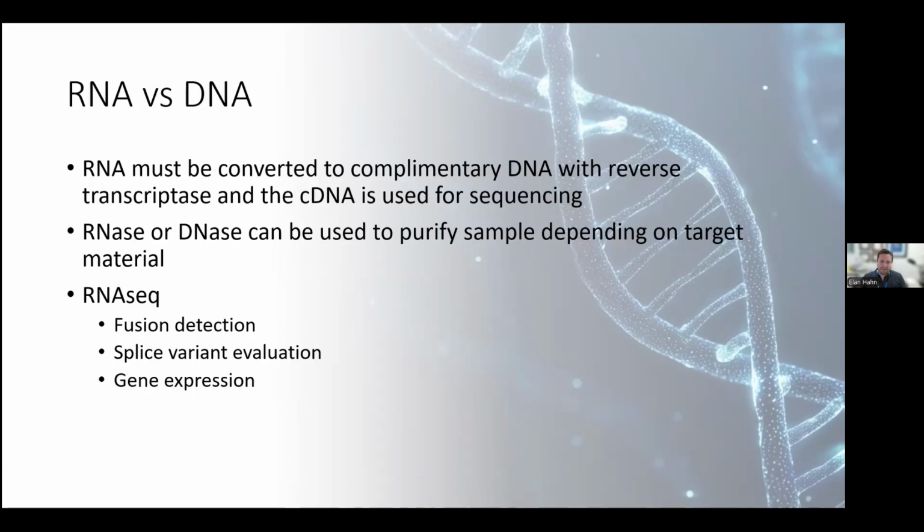The breakpoints tend to happen at variable locations in introns, which are very long and hard to cover. But the fusion gene is transcribed into mRNA with just exons, which is much more reasonable and covered in a much easier way with high confidence.